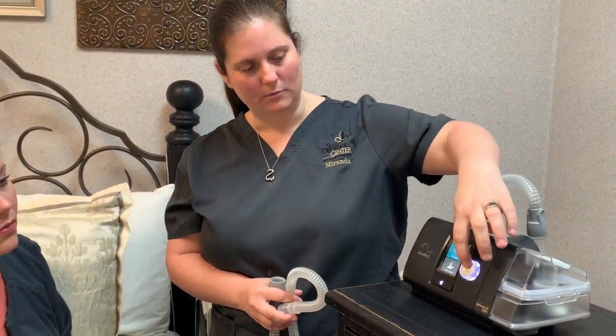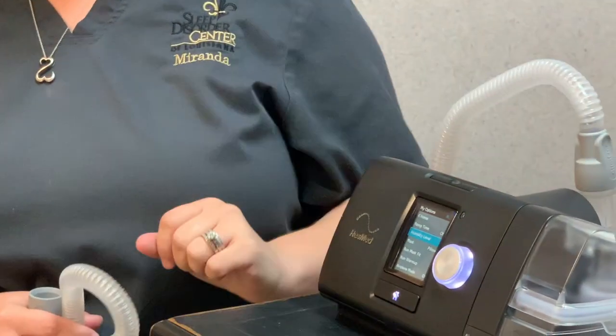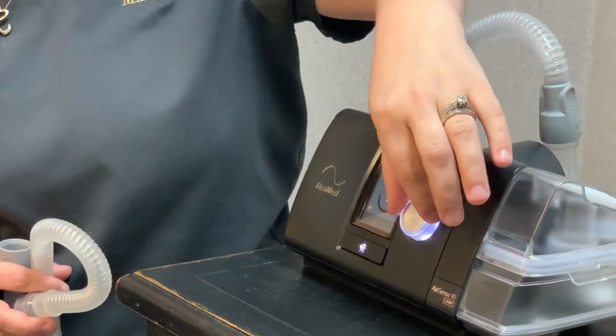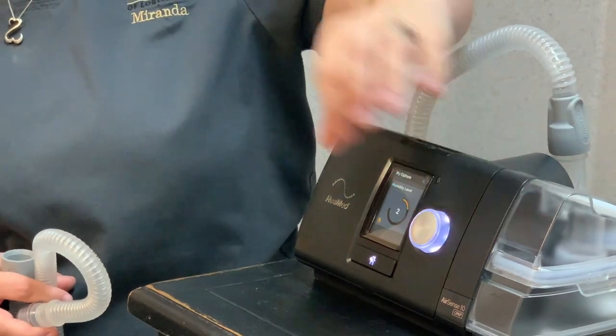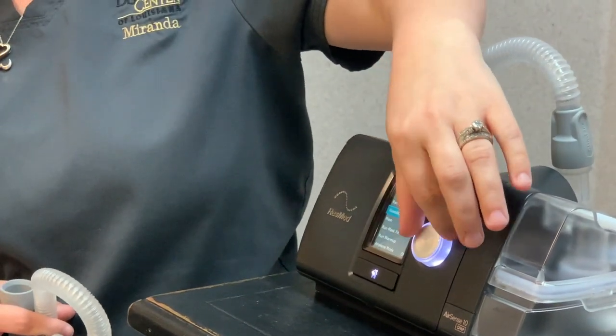You can hit your home button and it's going to bring you to your options. Your humidity level is in here, so if you need to change that you just click and you can go up one at a time or go down one at a time.